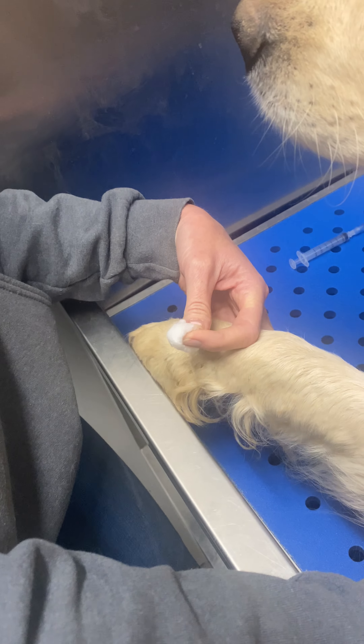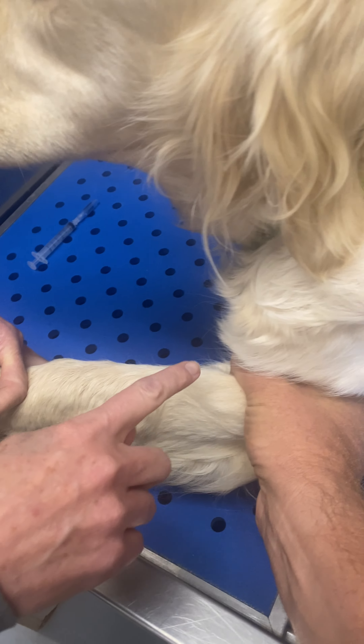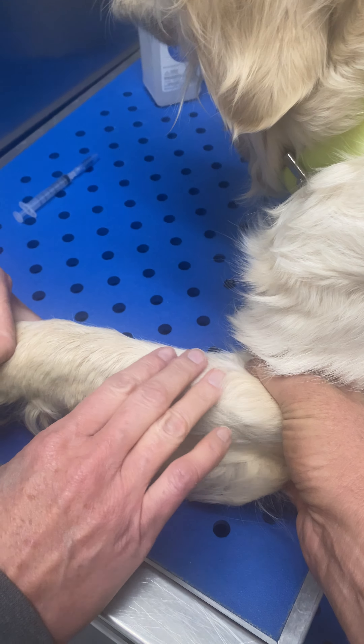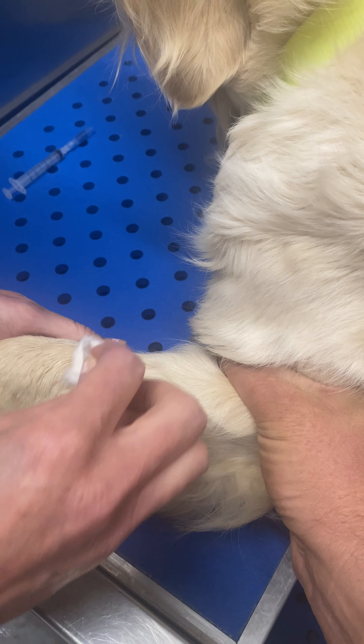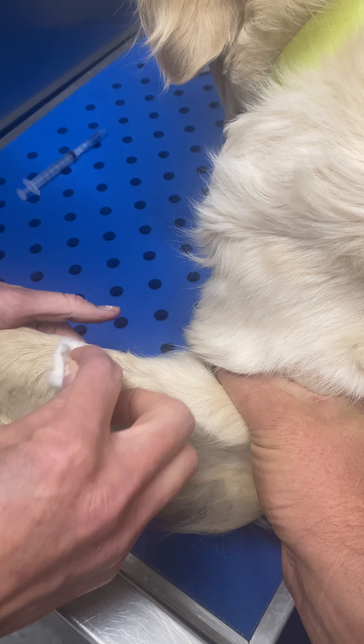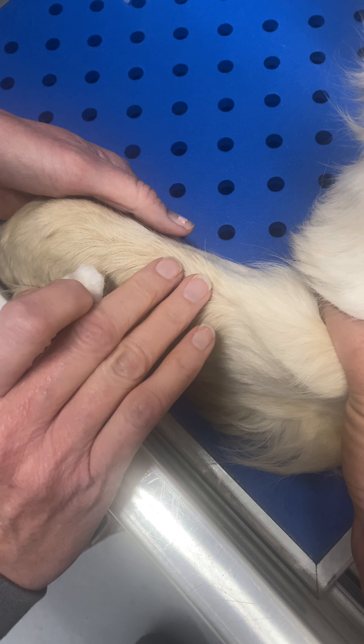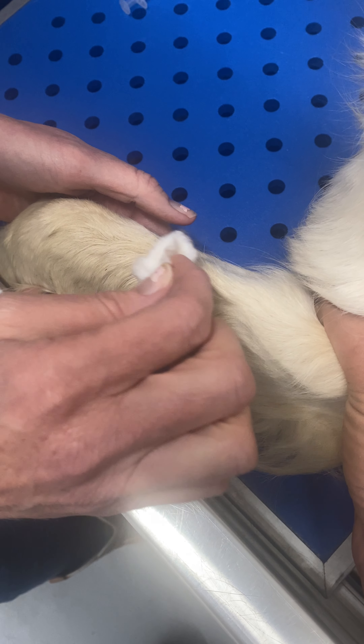What you want to do is cut off blood right here, and we're going to be filling up that vein right there. I'm going to just kind of lay that hair down so you can see that vein poking up right there, and you can feel it with your fingers.